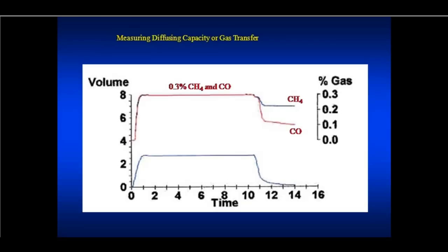And when they hit the button, the patient takes a deep breath in, then they hold their breath for 10 seconds. And that's where the technician, you walk by the door saying, hold it, hold it, hold it. And the patient's there turning red and sweating. Sweat is dribbling down their face. They're doing a DLCO maneuver when you see that. Now, when the technician pushed the button down, it gave the patient this gas mixture here, 0.3% of methane and 0.3% of carbon monoxide. Okay?